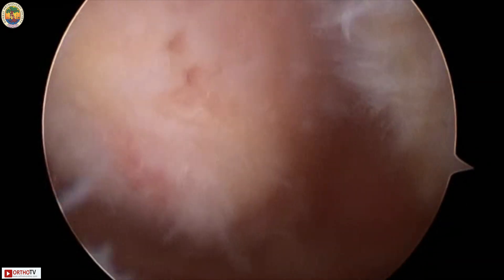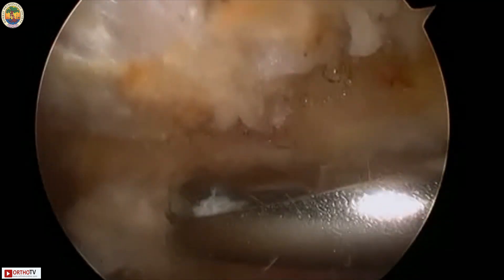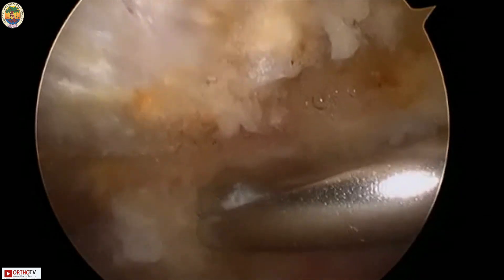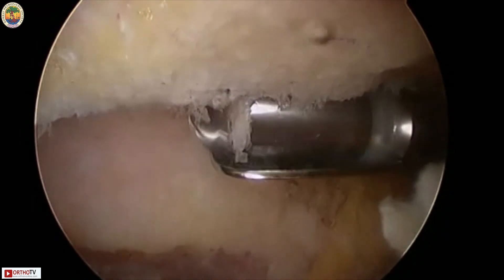It is important to see the posterior corner very well. Once you've removed the bursa and the capsule, we then do an acromioplasty at this stage if needed — and mostly we do need to do one, because there may be spurs on the inferior surface of the acromion or clavicle. This may be a case of AC arthritis, and many times if you do an acromioplasty you can see the inferior clavicle very well.